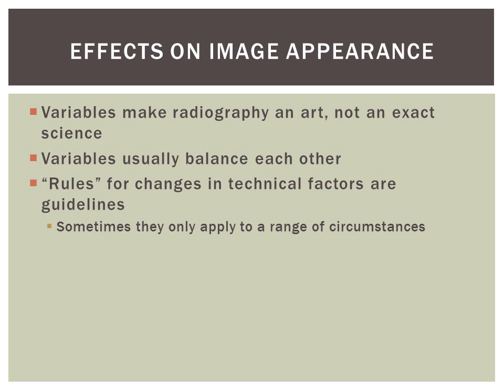So what do you have to see in a change of density? Remember that we need at least a 30% change to actually visually see density. So what should we make changes in? Remember back when we discussed that if we want to make a change in density, we're going to use halving or doubling. Because if it takes our eye 25 to 30% to visualize it, then we need to make it big enough so that we can adjust for that.